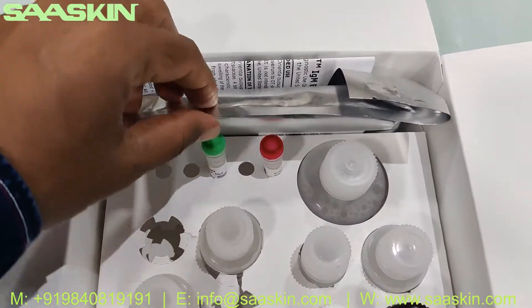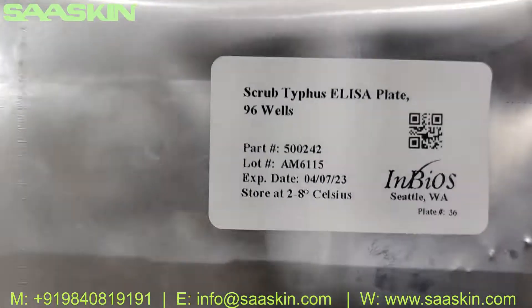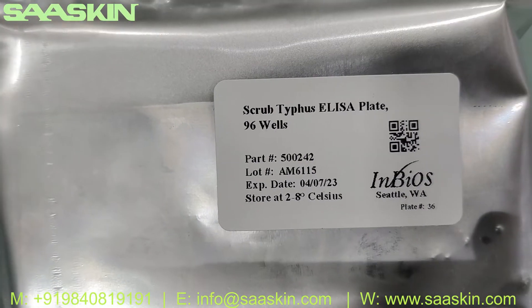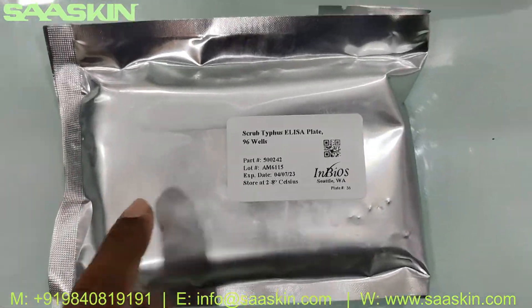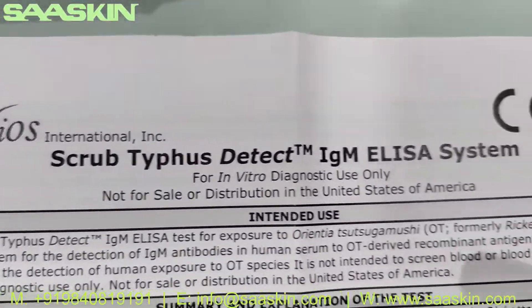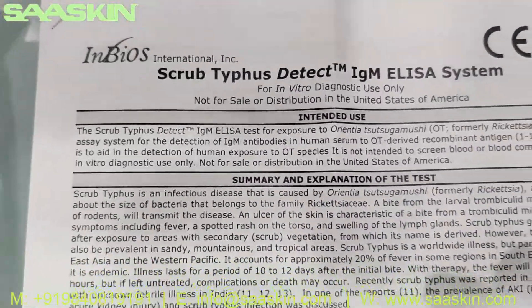Let me open this for you. Here are the contents inside the box. You typically have the 96-well plate for the ELISA kit — this is the Scrub Typhus ELISA plate, 96 wells. You also got an IFU brochure, which says 'Scrub Typhus Detect IgM ELISA System.'